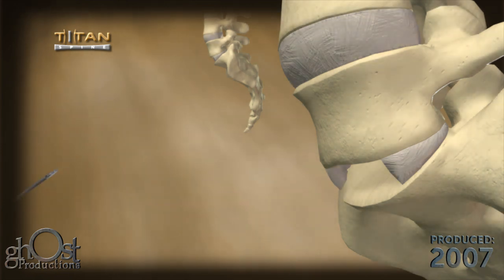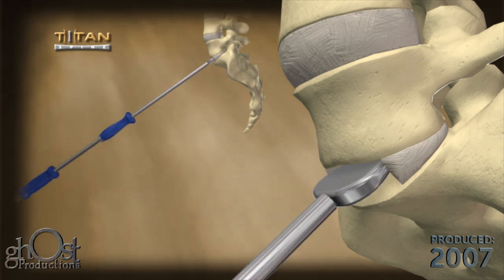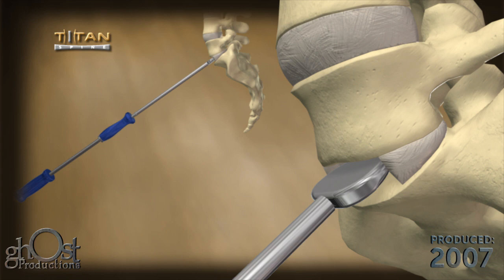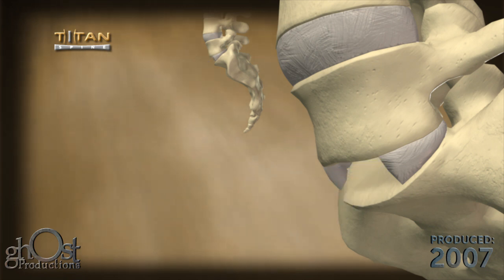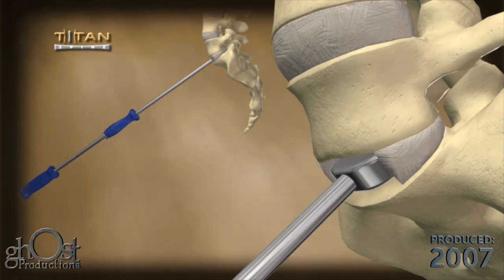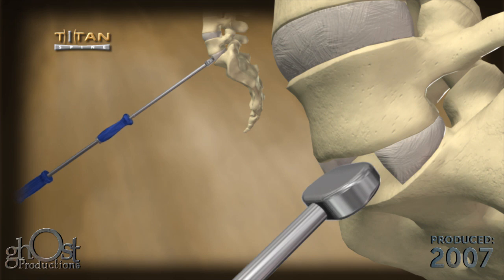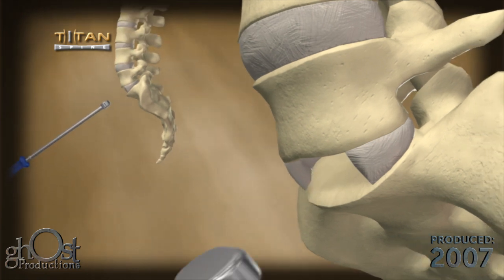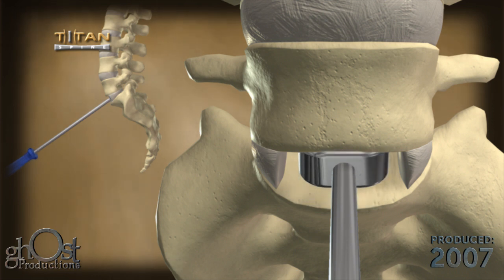Distractors are inserted into the cleared disc space, beginning with a 9mm size and increasing in 1mm increments until the correct sizing is reached. Lateral C-arm fluoroscopy is used to follow the insertion of the distractor to the posterior disc space. Leave the final distractor in the disc space and verify the center position.